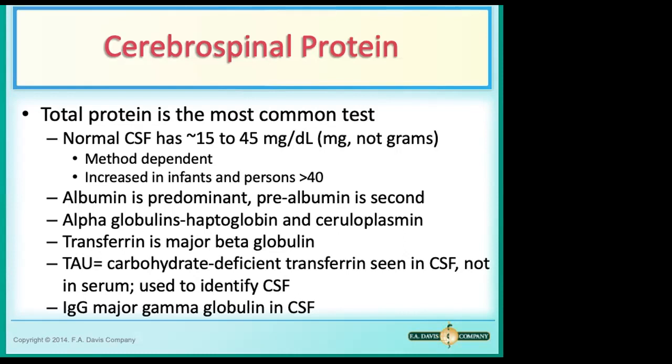Okay. Some abnormal values result from alterations in the permeability of the BBB, the blood-brain barrier, or sometimes due to increased production or metabolism by neural cells in response to some sort of condition. So clinically, it is important that we determine the chemicals that are in the CSF, and only a few of them, like the proteins, the glucose, the lactate. It's not a lot of tests that we can perform on the CSF, but when we do perform them, they are significant and they mean something.